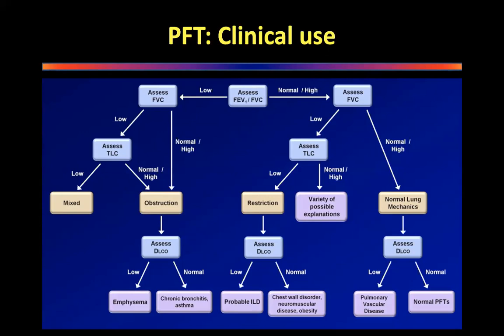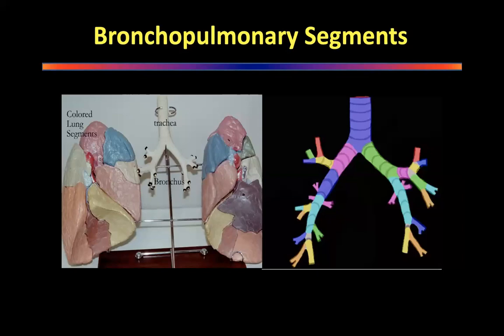Spirometry will not give you all the answers. Very often spirometry may be normal, but your volumes and your DLCO will change. And that will directly change your decision on whether to operate or not to operate. So it's very important. Okay, so don't think that these PFTs are just one test. I know people who have operated on lobectomies and haven't even done PFTs. I've personally seen this situation. And it is criminal. It's criminal if you operate on a patient and don't do PFTs. Not acceptable in the modern world, okay?